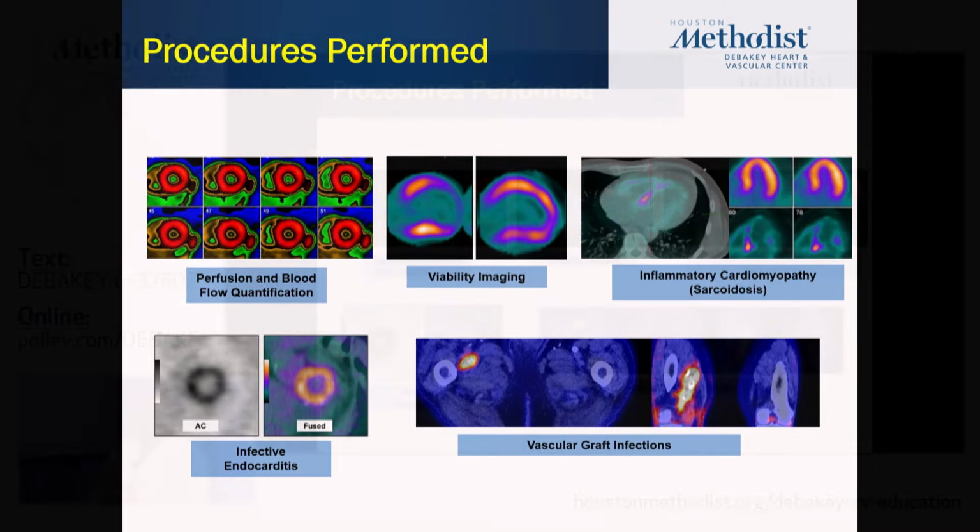So for the indium white blood cell scan, I wouldn't say it is obsolete, but if you want to detect infection, most practices now move toward PET if you want a more sensitive test. Although there are scenarios where you may potentially need both of them to have complementary information.